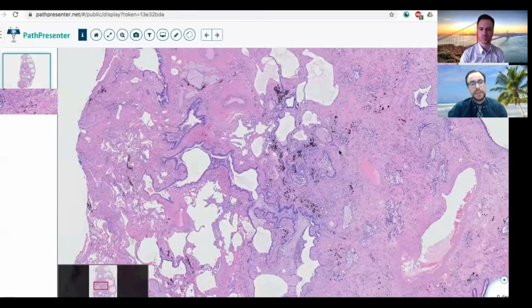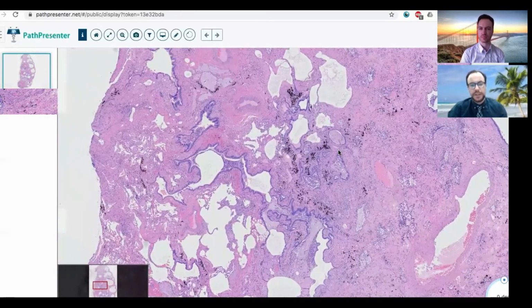Perfect. And then in terms of radiology, I know it's a bit challenging because we often don't get exposed to a lot of different radiology, but it can be really helpful in these cases, comparing the morphology with the radiology. So that's why I included it there. Okay. So you're exactly right in terms of UIP. The UIP cases tend to be lower lobe predominant, basilar reticulations and fibrosis, and they really have prominent honeycomb change.